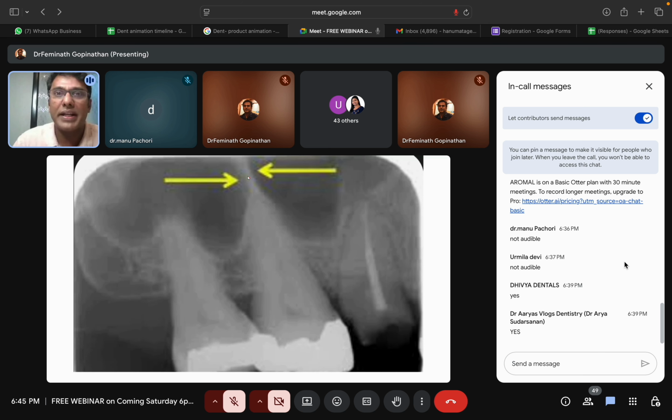See, this is another area. You can utilize these areas for placing implants, provided it should be wider, a little more mesiodistally. Always buccolingually there will be width for the nasal septum, maxillary sinus septum. But mesiodistally sometimes the width can be less. But you can confirm it from OPG or by CBCT, preferably CBCT, before you decide whether you are taking the maxillary septum as the target area.